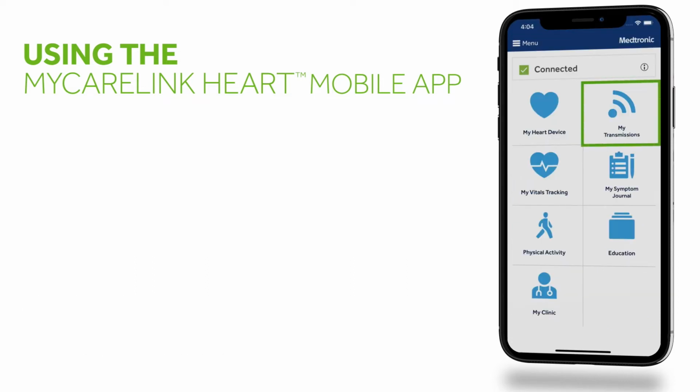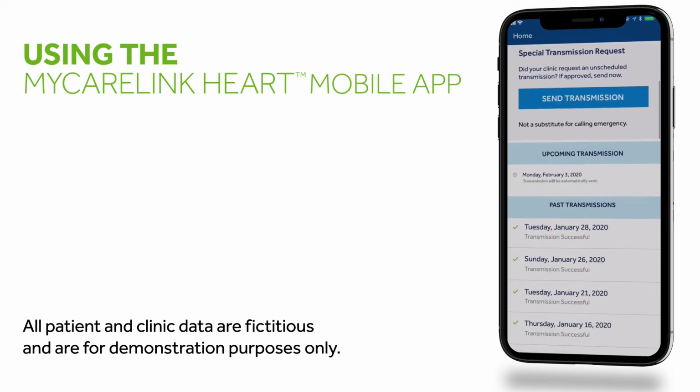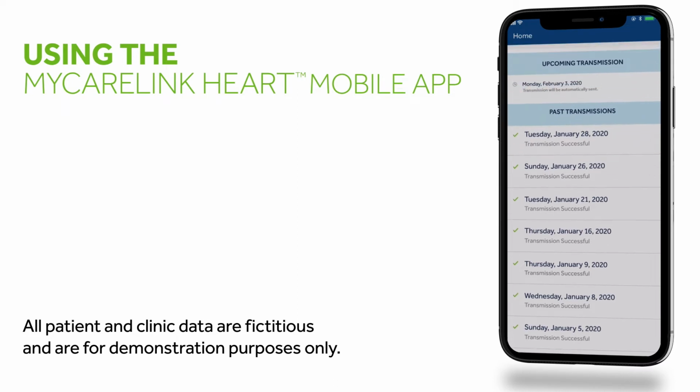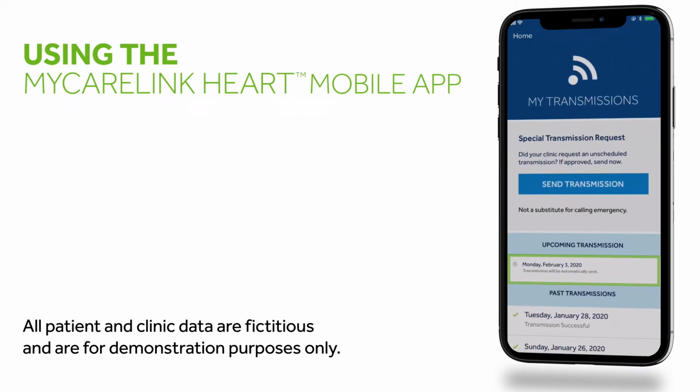The My Transmissions tile helps you feel confident that your clinic receives your heart device data, because it allows you to see your last successful transmission, view upcoming automatic transmissions scheduled by your clinic, and send a transmission when your clinic requests it.